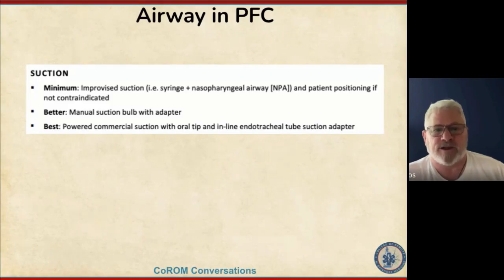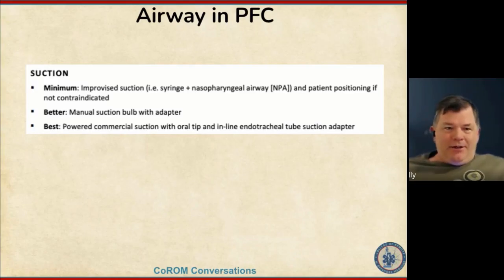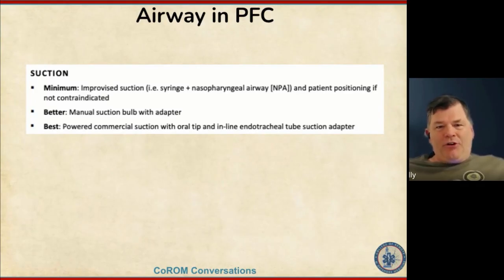So whatever improvised suction device you have, practice it and find out when it's going to work, when you can make it work consistently, and when you can kind of go, you know what, I'm not going to be able to pull peanut butter through this tube. So I think part of that is just becoming very familiar with your equipment, not just having it, but knowing how it works and when you can anticipate that it's not going to work. And you've got to practice with chunks, like pea soup, or maybe some chunky soup from Campbell's. It's not always just pure liquid that we need to suction up. And yeah, you've got to practice with that.